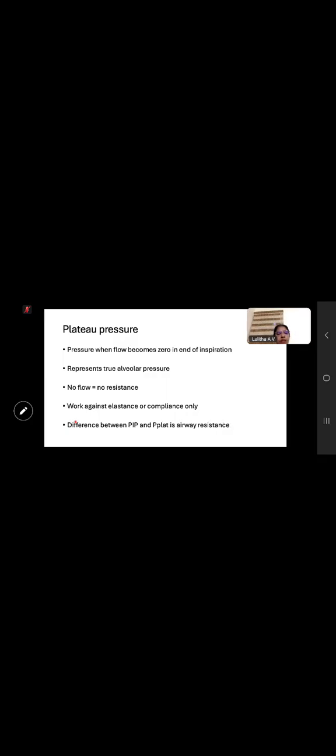Here it is PEEP, positive end expiratory pressure, then PIP. Then the inhalation stops and there will be some phase when there is no flow. The pressure almost drops. This is your plateau pressure, which is nothing but the alveolar distending pressure or transpulmonary pressure. Okay, so this is one beautiful picture if you can see how mechanical ventilation works.